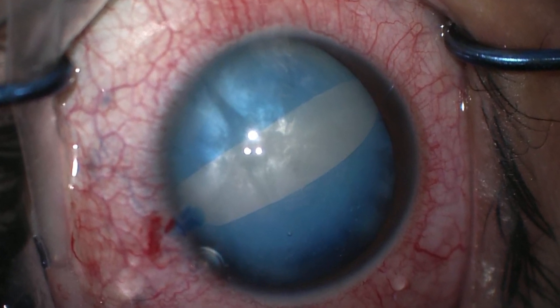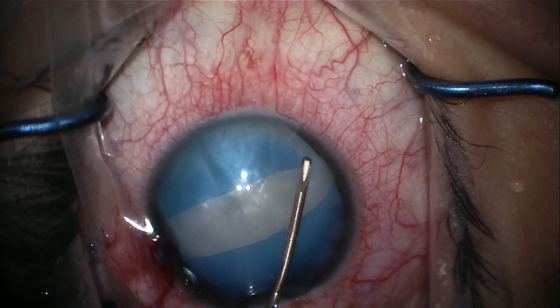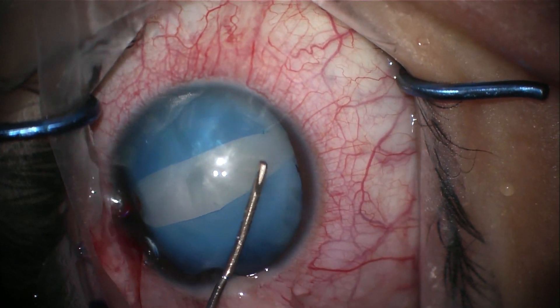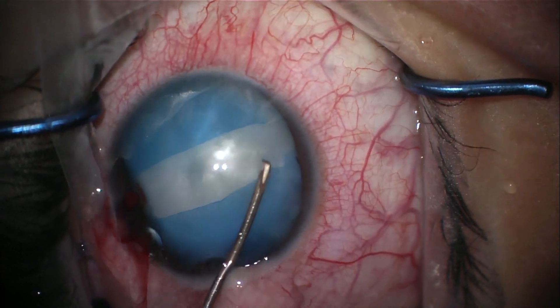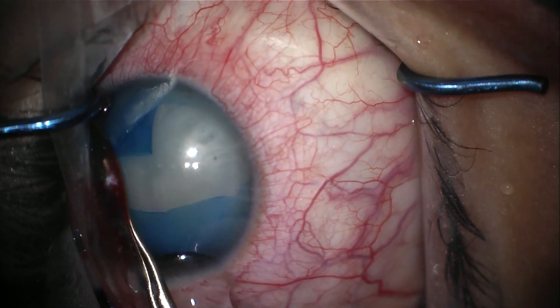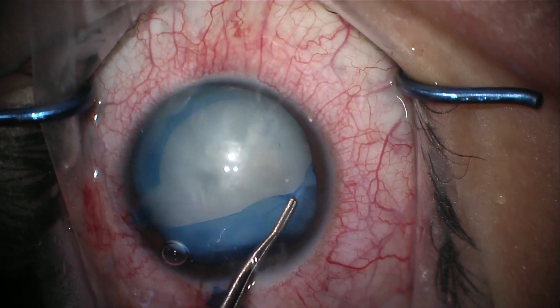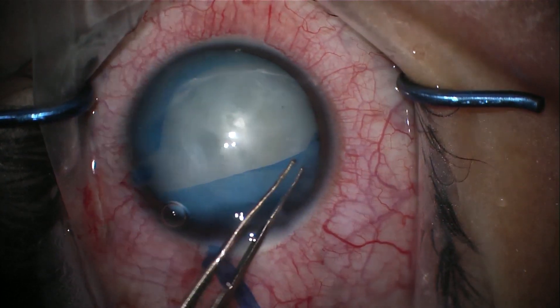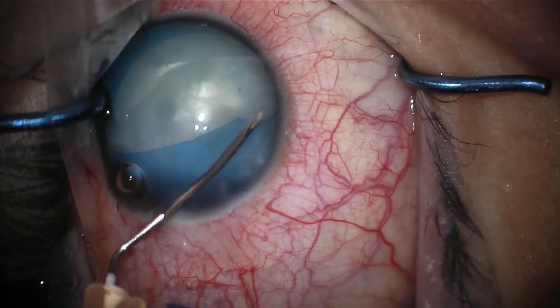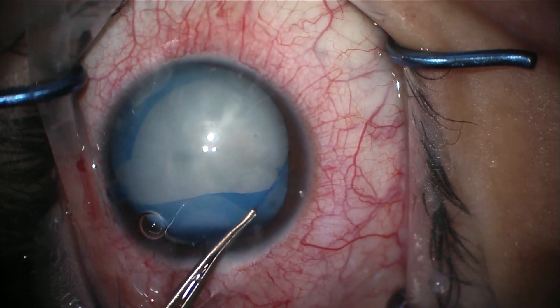Now we will show how to correct this complication. A cystitome is used to nick the two sides of the capsule. Using Utrata forceps, the first half of the capsulorhexis is made. The second half of the capsule was quite dense, so using a cystitome, the capsule was nicked again. Forceps are then used to complete the other half of the capsulorhexis.